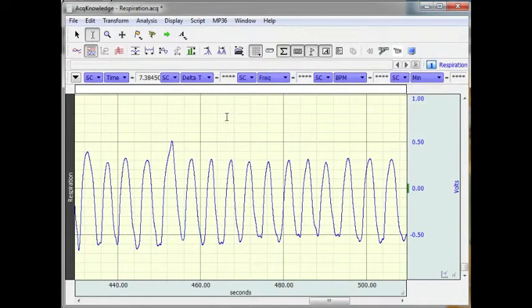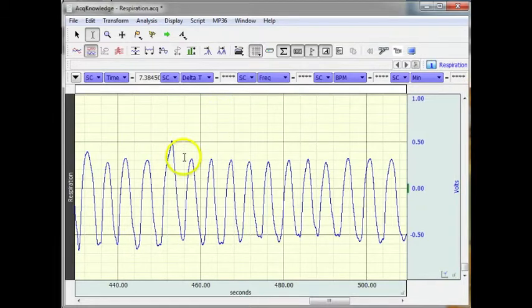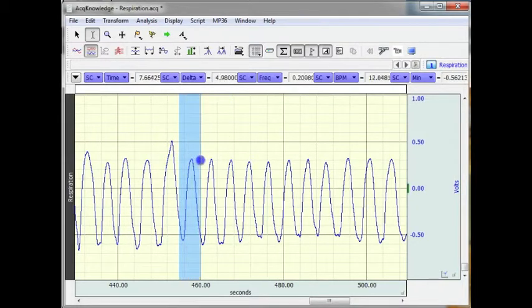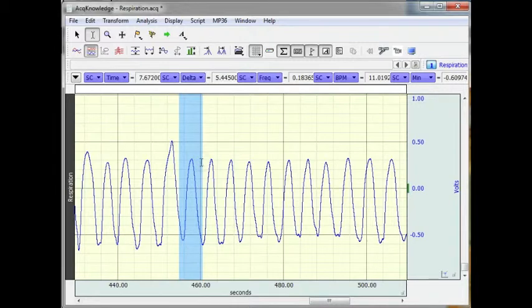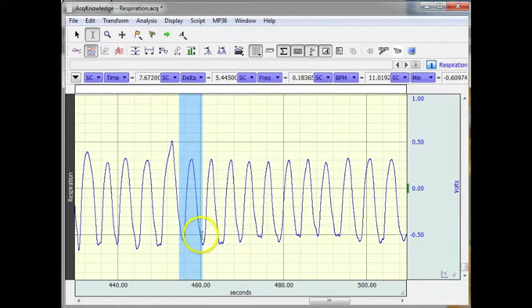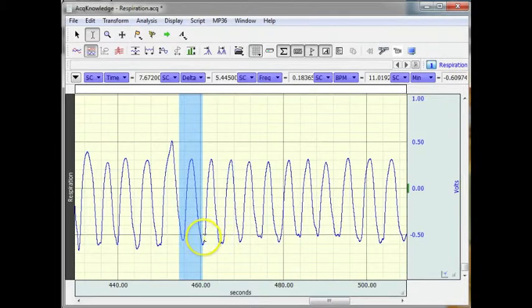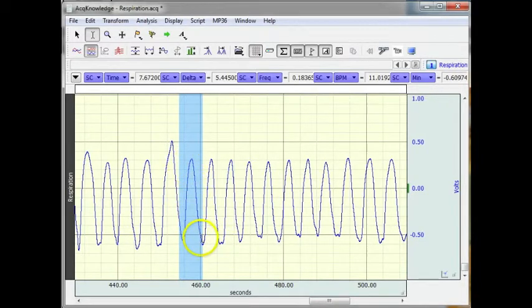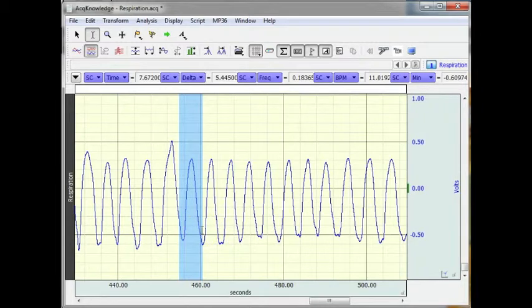What I am going to show in this demonstration is how to place an event marker at the peak of each cycle and place a marker there, do the same at the minimum point of the cycle and place a marker there, and then use those two events to locate another event on the waveform.